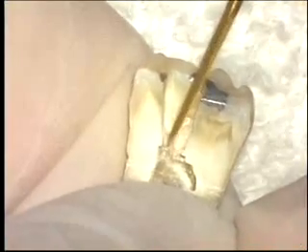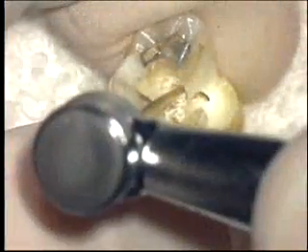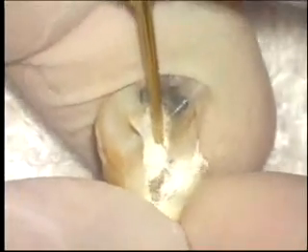Use of these instruments is similar to the diamond LA access burr — they are pushed smoothly into the canal orifice and tipped up while spinning to the access line angle, resulting in an ideal line angle extension. Unlike the diamond version, these burrs can also be used in the canal itself, helping to eliminate any irregularities between the access line angle and the canal orifice so all subsequent instruments and materials can be placed effortlessly.